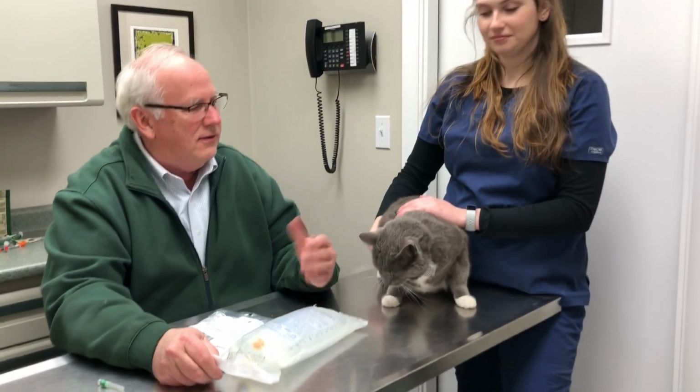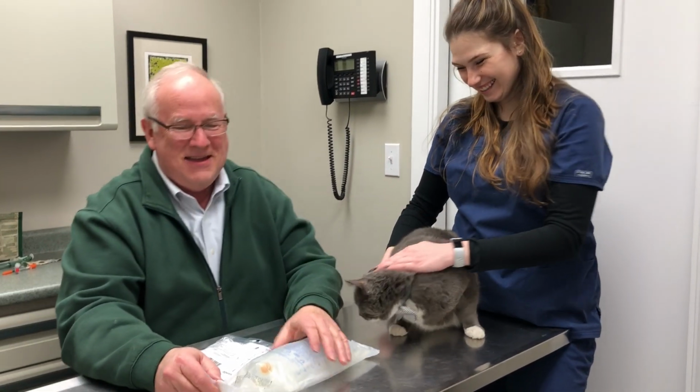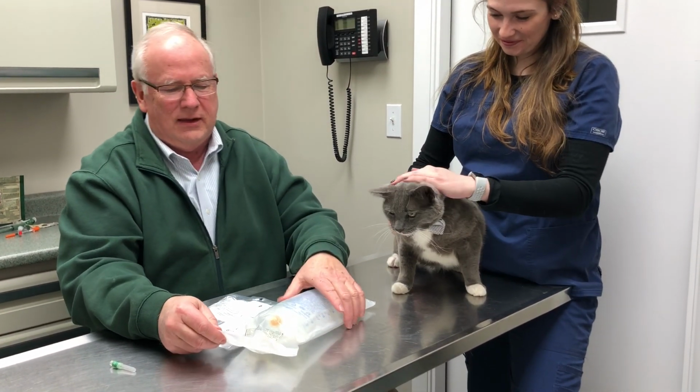Hi everybody, I'm Dr. Hawk. This is Manny, our model, and Kirby will be our IV stand today for holding the fluids. We're going to demonstrate how to do subcutaneous fluids in cats.